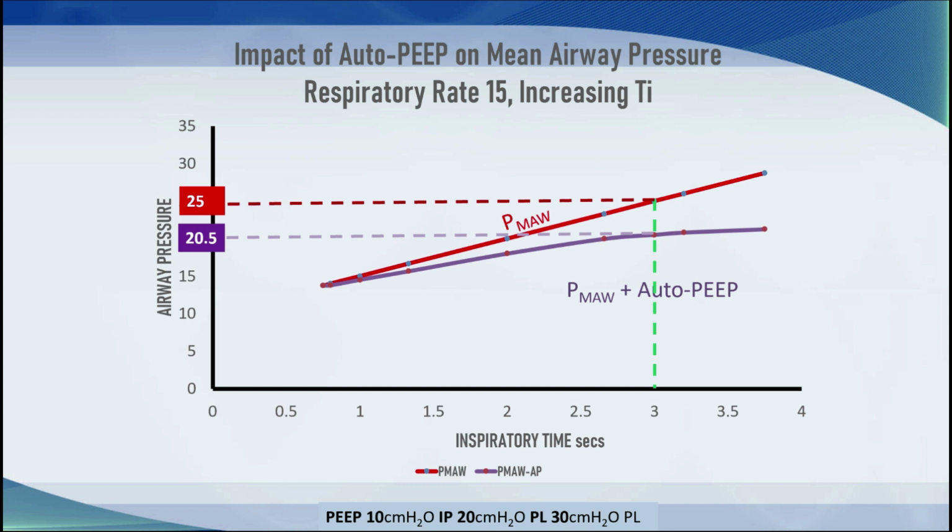And the reason for this is that there is a fall in the driving pressure, and the fall in the driving pressure results in a loss of the area under the pressure time curve. So you've got to find the right balance for your patient of using an inverse ratio ventilation versus losing the tidal volume. And the tidal volume is important.